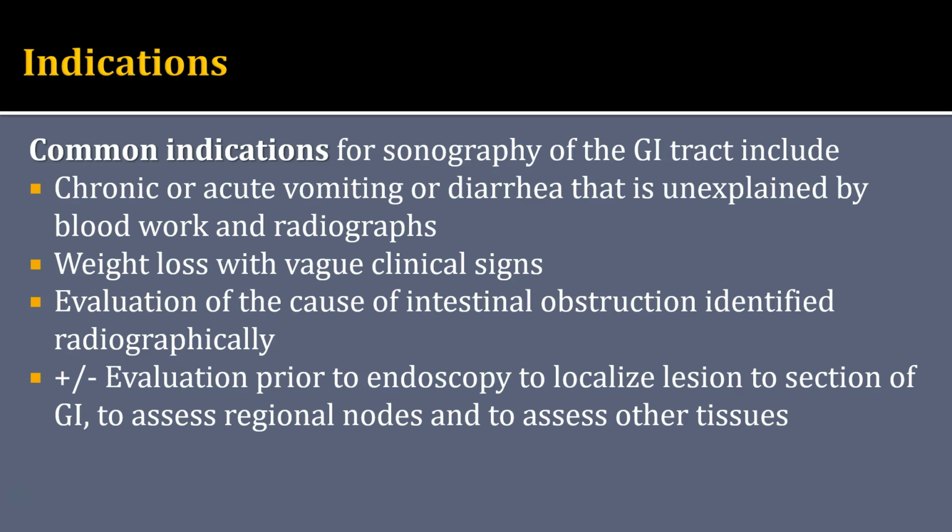Prior to endoscopy, we might consider ultrasounding, and that's more with the intent to make sure there's not a focal lesion that we couldn't reach with endoscopy, or maybe to see that the more diffuse lesion actually only affects the mid through distal jejunum, and that won't be able to be sampled with endoscopy either.